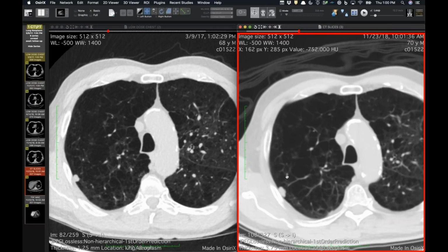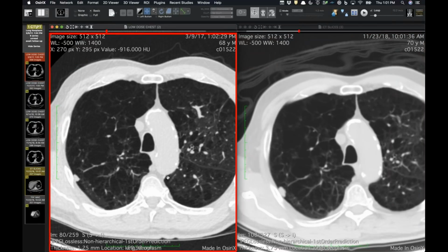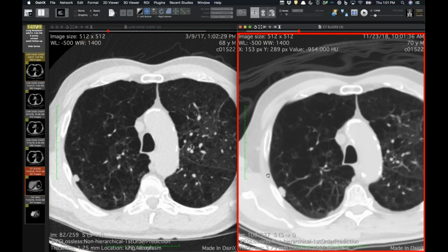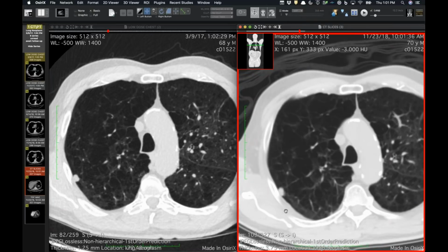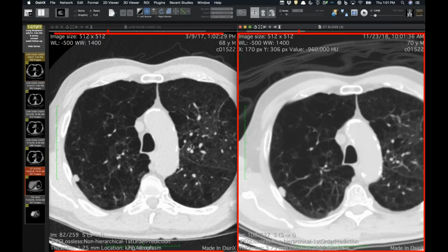I guess the issue with all these is at some point you have to decide what your threshold is to do something, because we just keep watching it. It's so peripheral, you could probably wedge it out pretty easily. Yeah, but I think he's got vascular disease, horrible lungs. I think they might just do SBRT without a diagnosis. But you would expect that, this being a screener, it should be high. So in the VA, are they screening patients who aren't lobectomy candidates? Yes. Wow. Because some of these patients will get SBRT if you find a stage 1.